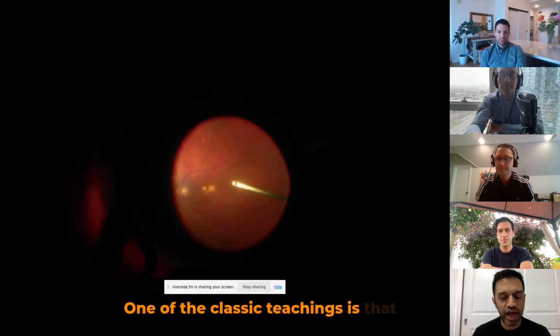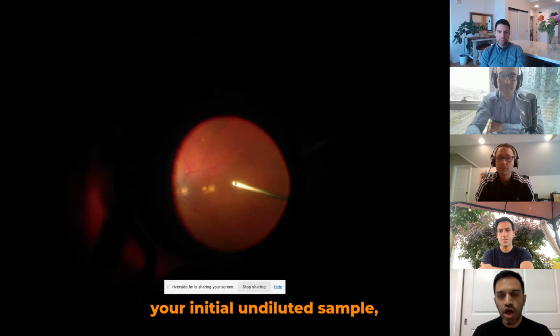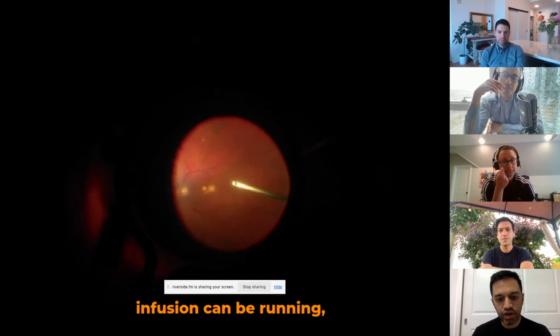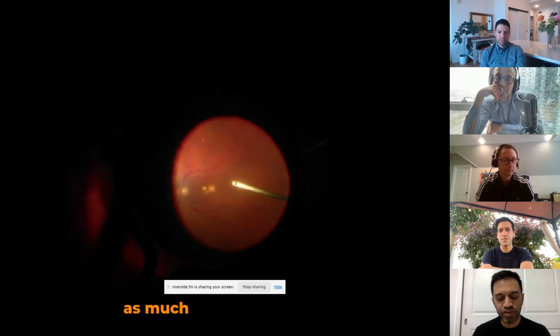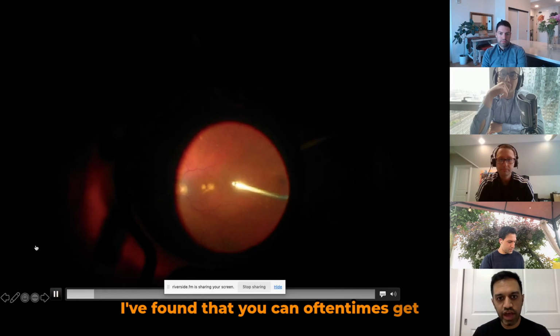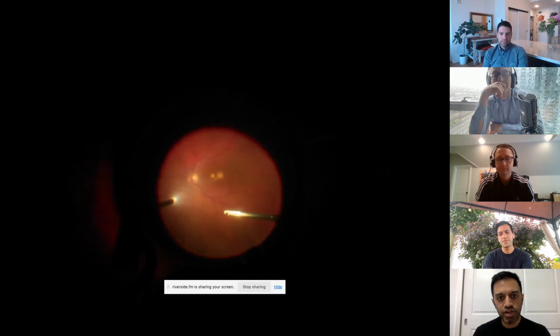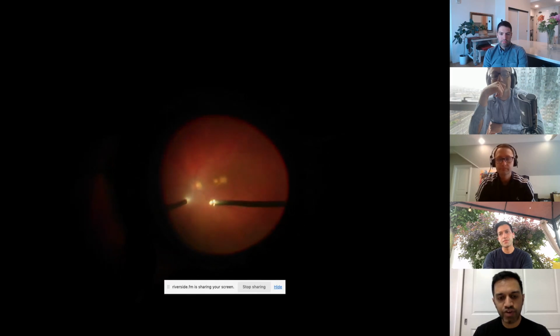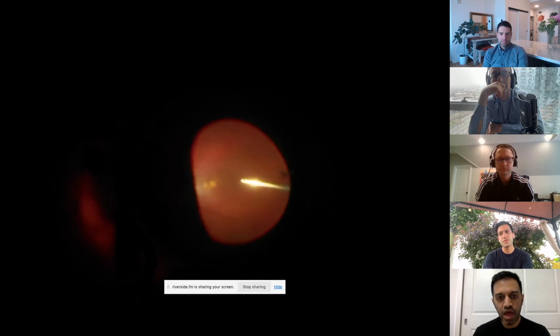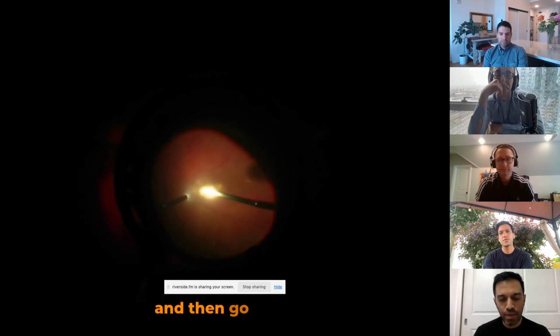One of the classic teachings is that you want to not prime it. When you do your initial undiluted sample, no infusion fluid can be running, and you want to get as much as possible before the eye just completely collapses, and then you open up the infusion. I've since moved away from this. I've found that you can oftentimes get a very good sample even with some partial dilution. So what I tend to do is aspirate as much as I can. Once it starts to collapse a little bit, I'll flash the infusion line, pulse it, and then go back to aspirating.